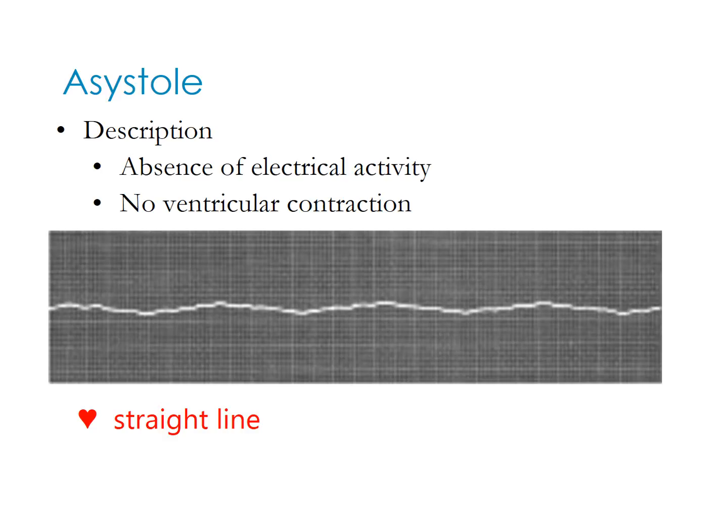Okay, and our last one, we're almost done here, guys. This is asystole. This is a total absence of electrical activity. There is no ventricular contraction. You may hear someone say, oh yeah, they're flatlining. That's asystole. This will be indicated by a straight line that you will see on the ECG or EKG. And you look at the straight line, there is maybe some curves to it, but you can tell that's not even a fine VFib at this point.